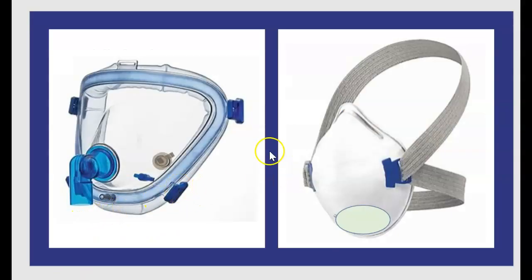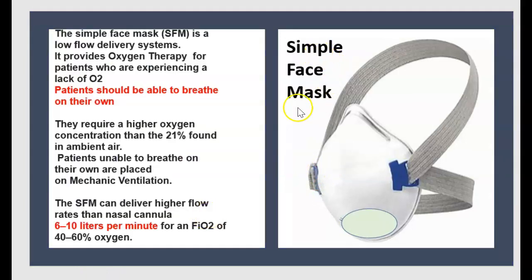Next is the face mask. The simple face mask is a low-flow delivery system. It provides oxygen therapy for patients who are experiencing lack of oxygen. Patients should be able to breathe on their own. They require a higher oxygen concentration than the 21% found in the ambient air.